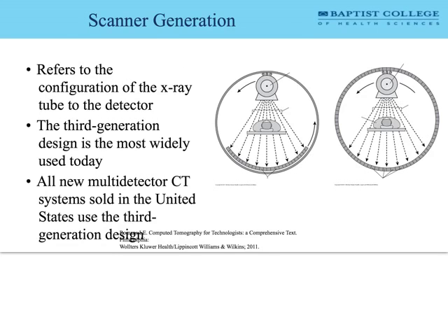Let's talk a little bit about these scanner generations. And the big thing here is we don't necessarily, if you notice just by the number of illustrations that she gives, we've got 3 illustrations of the 3rd generation and 1 illustration of the 4th, no illustrations of the 1st or 2nd generation. 1st and 2nd generation scanning just helps us understand how the technology evolved. But the big thing to understand about 1st is that it's defunct. We no longer use 1st generation scanning.